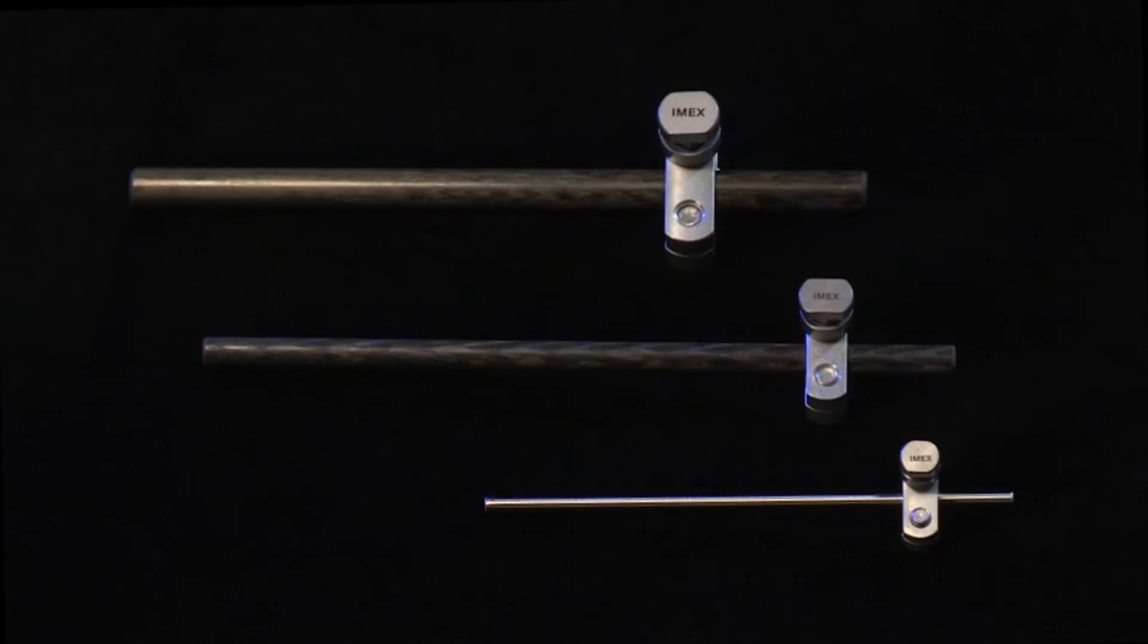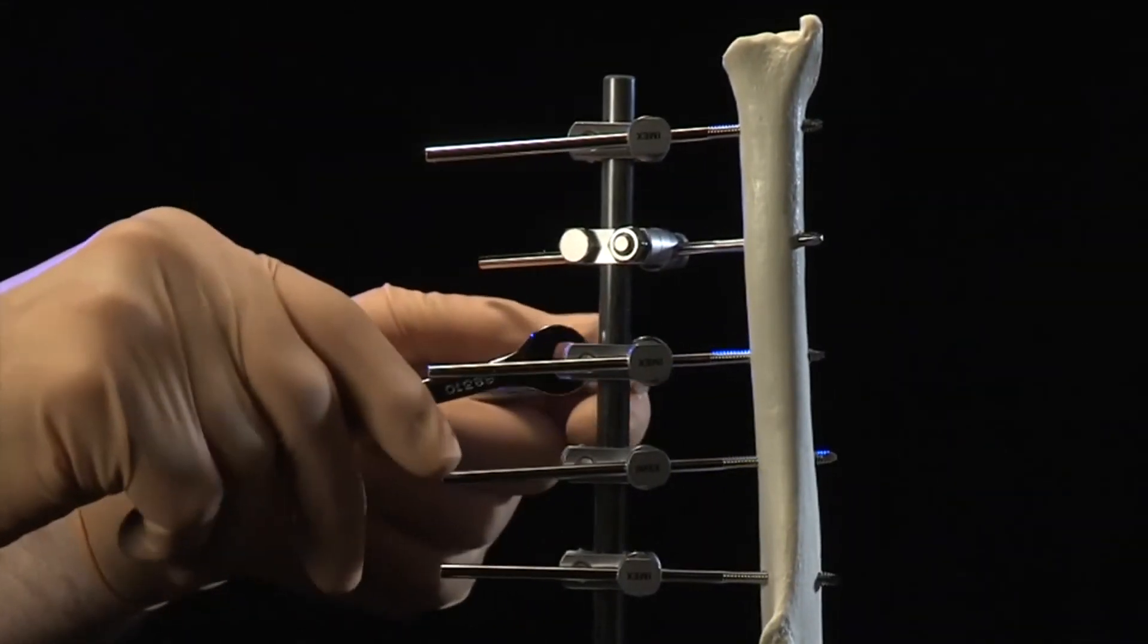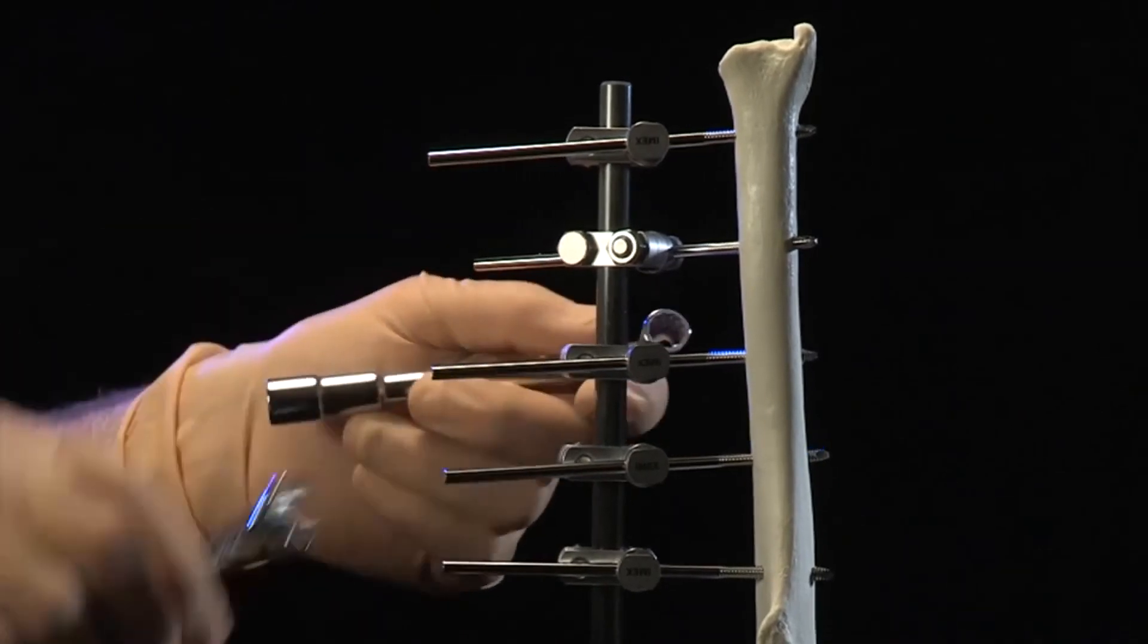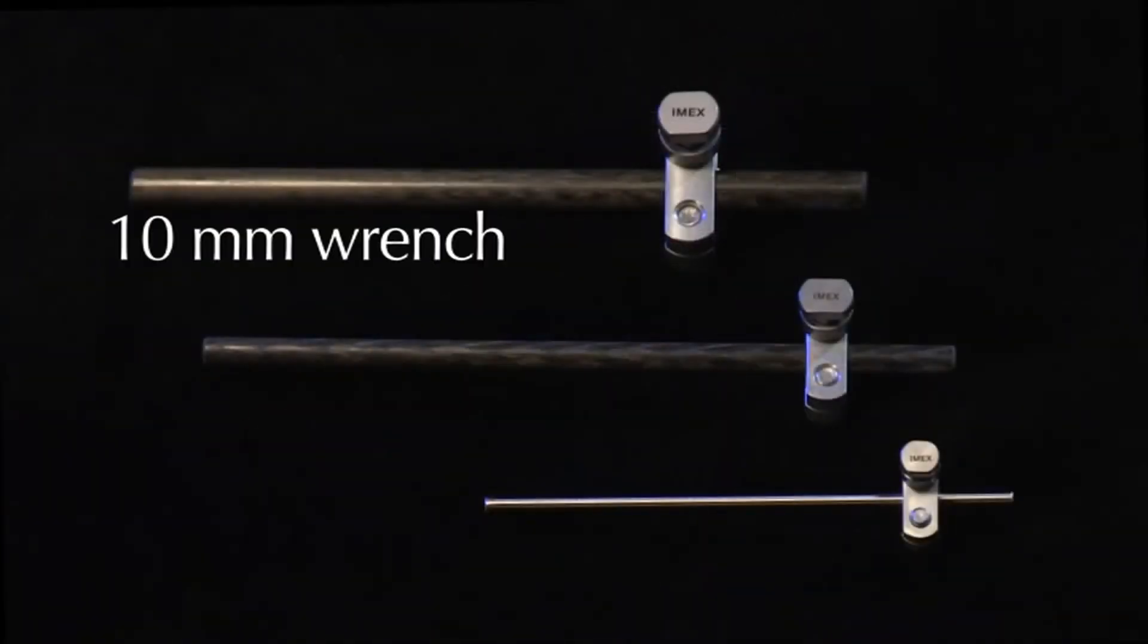The large SK clamp grips pin diameters ranging from 3 mm to 4.8 mm. The large SK clamp utilizes a 10 mm wrench to tighten all bolts and provide any desired counter torque. The large SK clamp supports connecting rods of 9.5 mm in diameter, which are available in carbon fiber or aluminum.